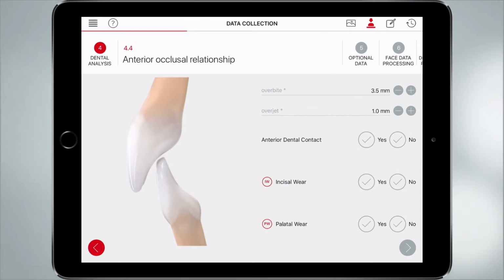So again, we normally measure the overjet from the back part of the upper teeth and the back part of the lower teeth. This is the total amount that is visible for the dentist using the probe from the noon position, if the working position is the noon position. But we also have to understand that this value may not be the functional one. The functional one, if you have a shortening of the upper incisal wear, will be different, because if you go more to the apical position, the thickness of the incisal edge becomes greater and greater.